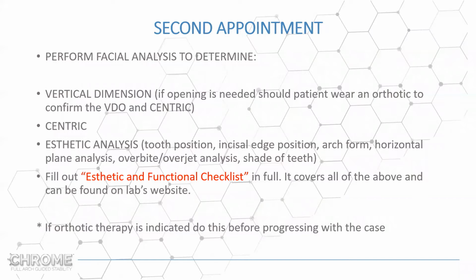As an asterisk to this, if orthotic therapy is indicated, we suggest that this process be done before we progress with the case. If the bite has to be open 3 millimeters or more, that's a significant amount, and some people can tolerate it, some people can't. What you will experience most of the time is that doctors don't want to let their patients wear them very long because the patient's anxious for surgery and wants to get the case moving. So they might wear it maybe a week, or however long the doctor sees fit, or they might just equilibrate it right there when they see the patient the first time, and say this is going to work and we should continue with the case.